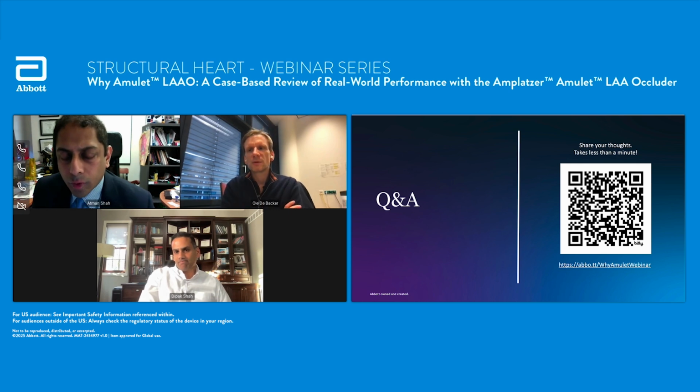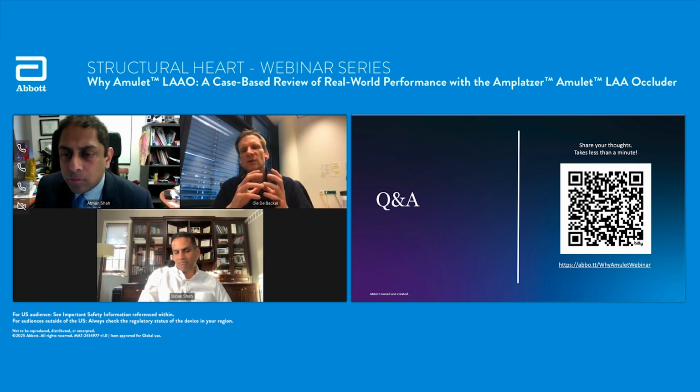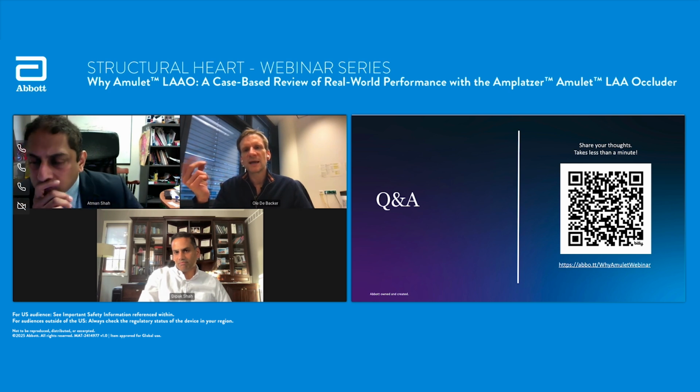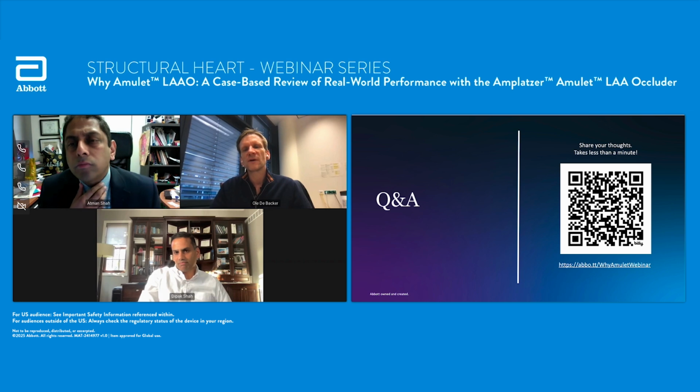I agree. I mean, on CT, you can see the proximity of the pulmonary artery with the landing zone of your LAA. And if you would have any concern, either you go for another device, or you also should avoid what I would say is over compression of your device. Yes, I mean, typically it's an issue if you have over compression of more than 30% of your device, then these anchoring barbs, they can extend quite far. So I would say try to avoid over compression of your device, and you can see it on CT as well.